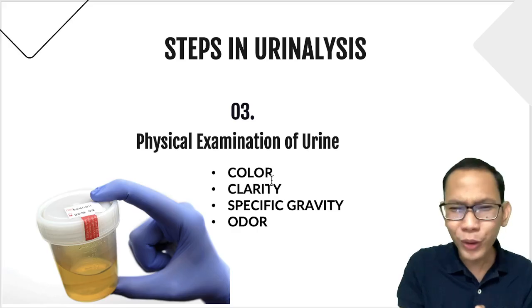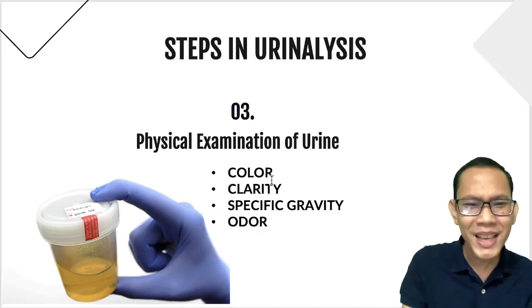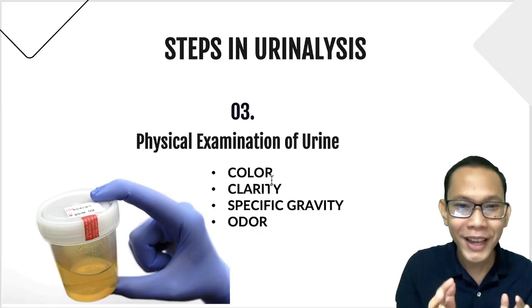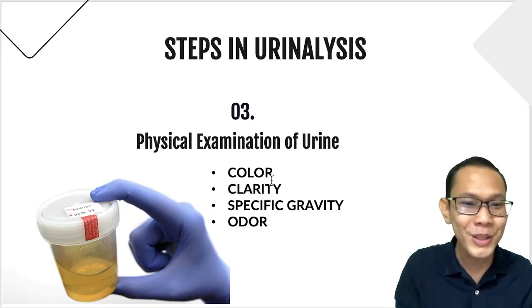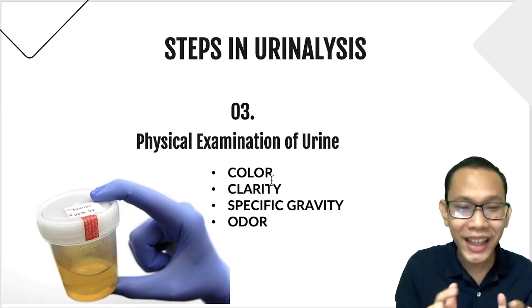But sometimes in the color, of course, magkakaiba talaga kami ng mga color differentiations. For me, it's yellow, light yellow. But as long as you are of the same spectrum na your sample is yellow, that's fine. But kung magsabi ako ng yellow and sa kanya it's red, then that's going to be a problematic result because a red color and a yellow color will be very, very different. Like, sila na spectrum.